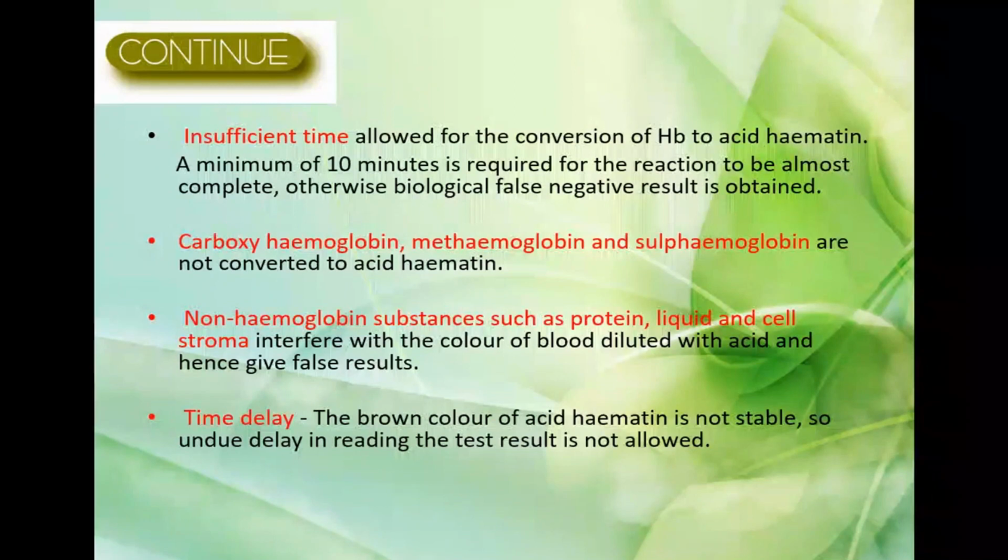So remember, while doing the experiment in the lab, when you come back to the offline classes, you have to be very sure that you are doing this. You have to keep it for 10 minutes, right?